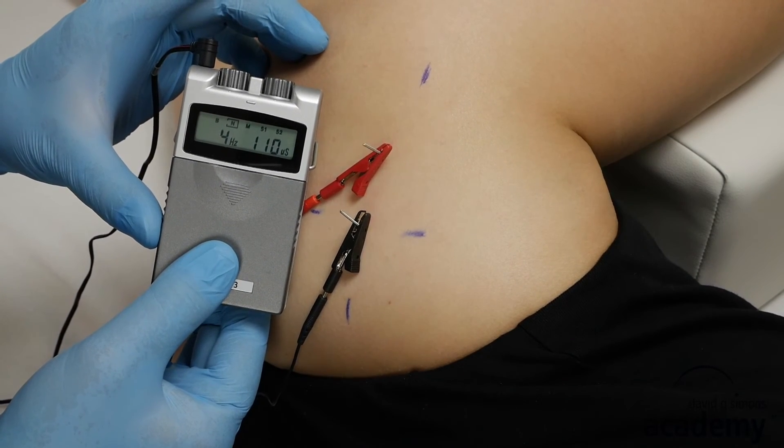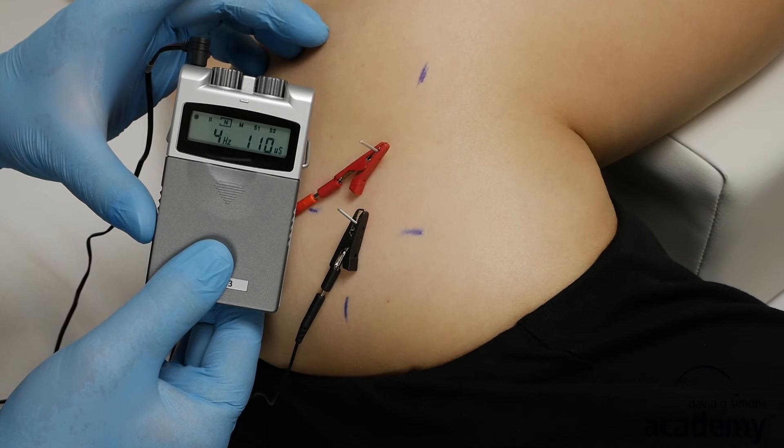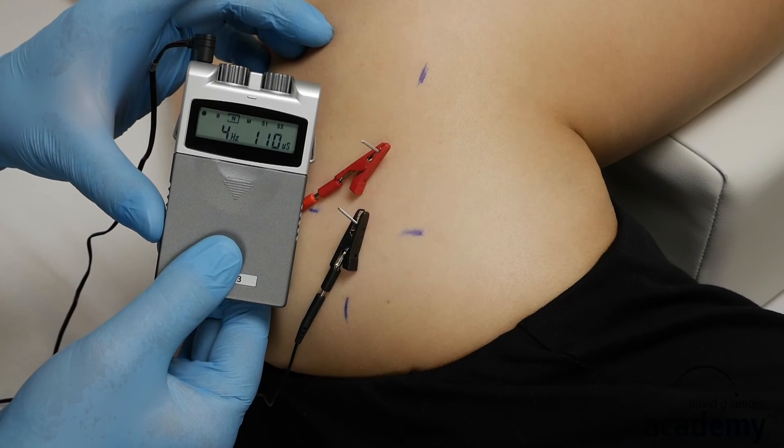To avoid strong post-treatment soreness, the duration of a treatment with intramuscular electric stimulation should not be longer than about 10 minutes on one trigger point. When you finish the treatment, turn off the current before you disconnect the electrodes.